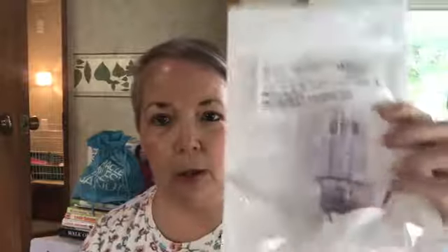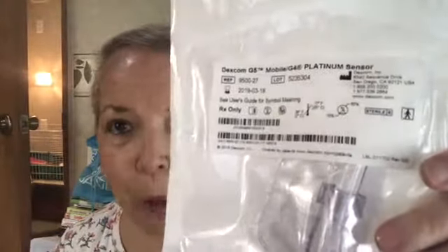Sometimes I insert it on my abdomen, sometimes I have it on my arm. But for today's video, I wanted to show you the sensor. When you get your package, you get a sensor. This is the sensor right here. You get it in a package just like this. This is the... oh my gosh, I can't speak today. Dexcom G5 Mobile G4 Platinum sensor.